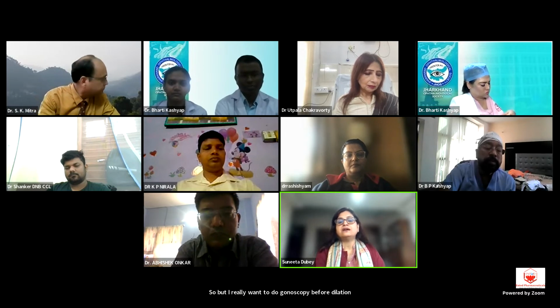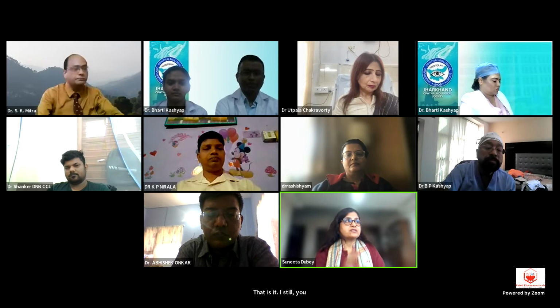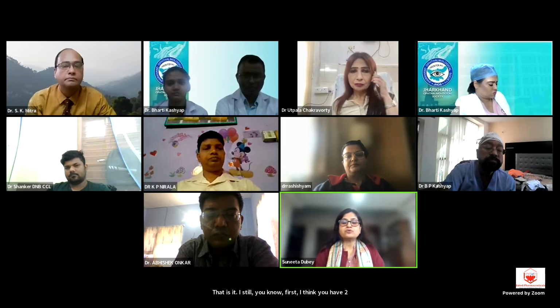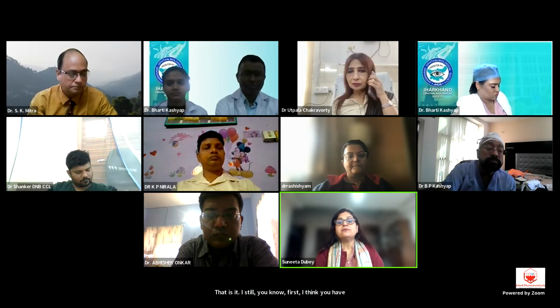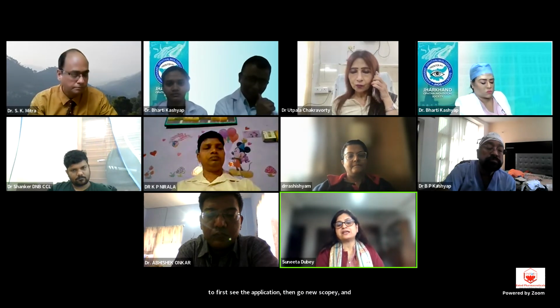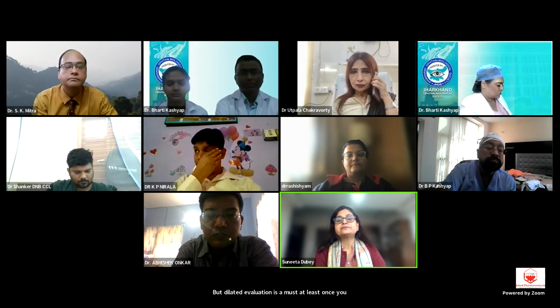First you have to see the applanation, then gonioscopy, and if the angle is open, then you can dilate. But dilated evaluation is a must. At least once you should dilate and see the disc and RNFL clinically.